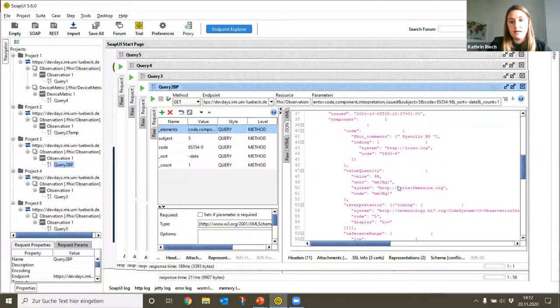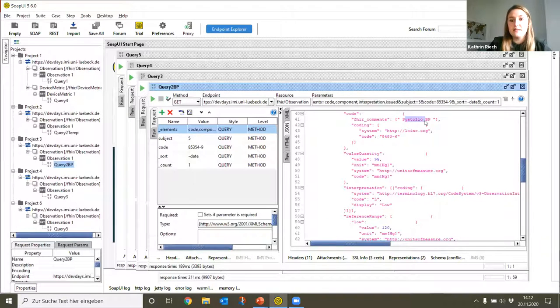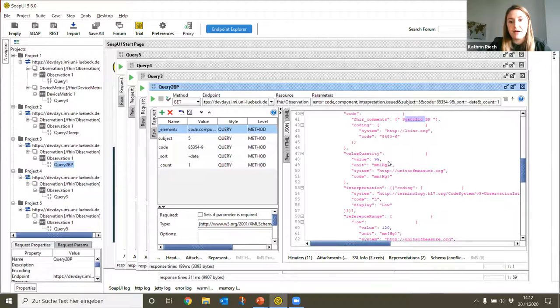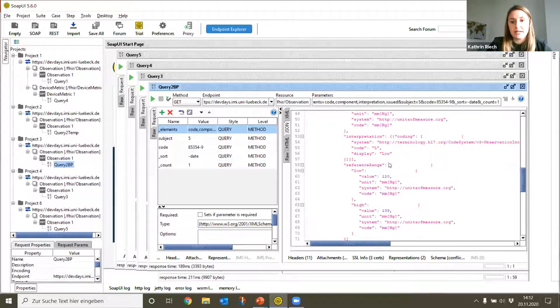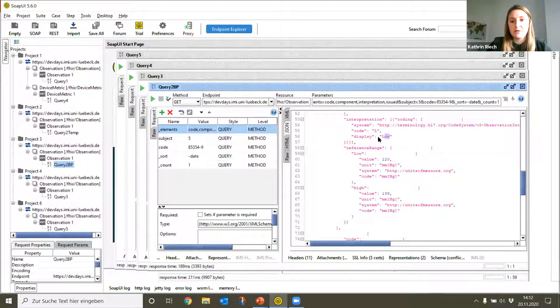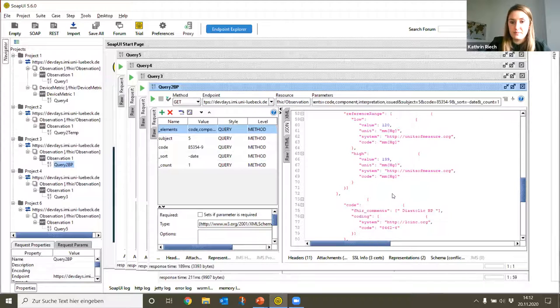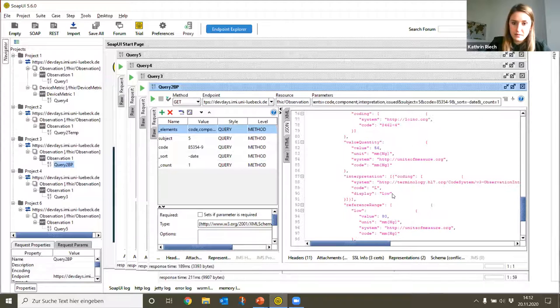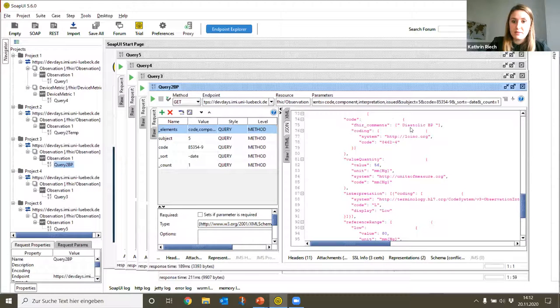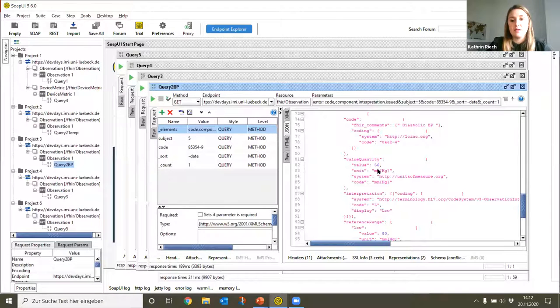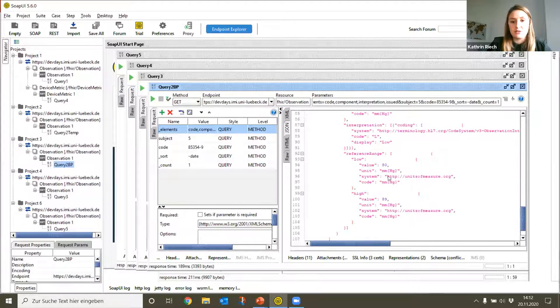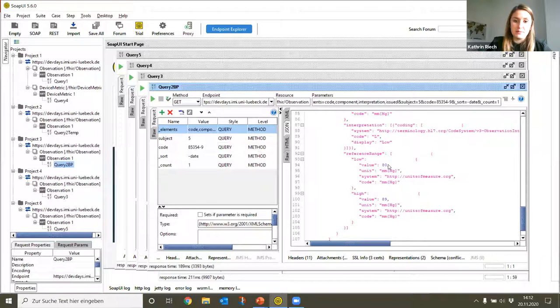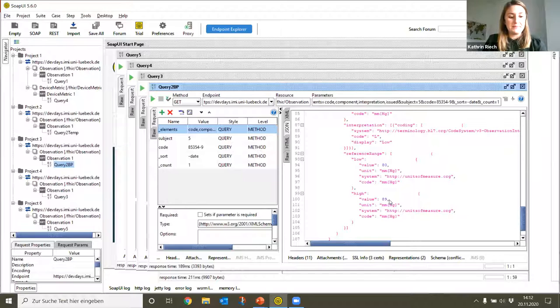As we can see here, our systolic blood pressure value lies at 95 mmHg, which can be interpreted as low. Normally it should be between 120 and 139. As well, our diastolic blood pressure value is low. It lies at 56 mmHg and should normally be between 80 and 89.